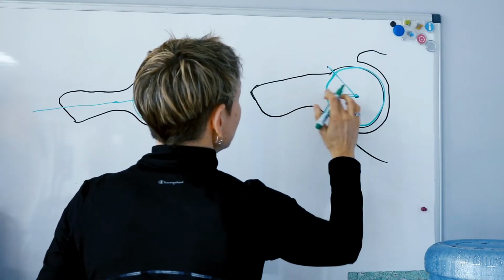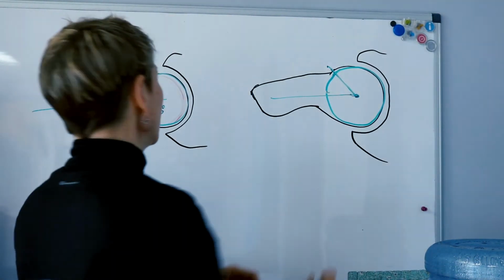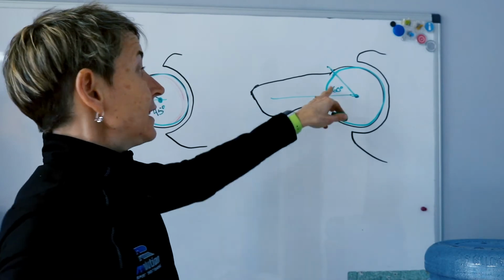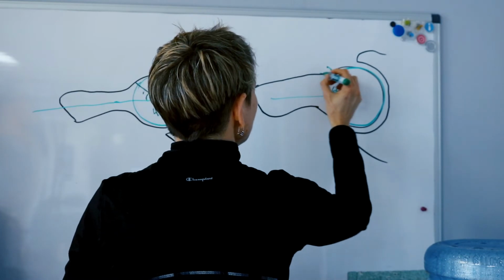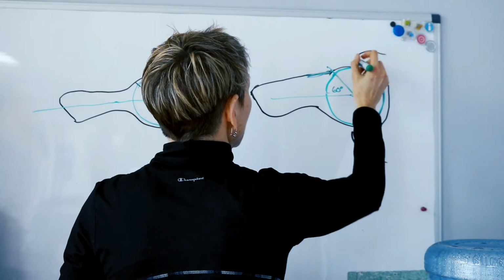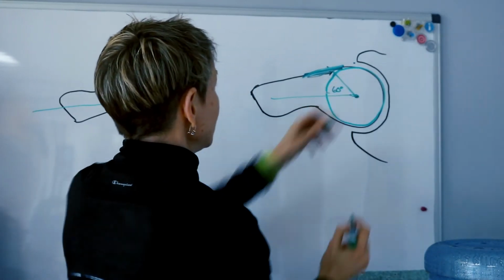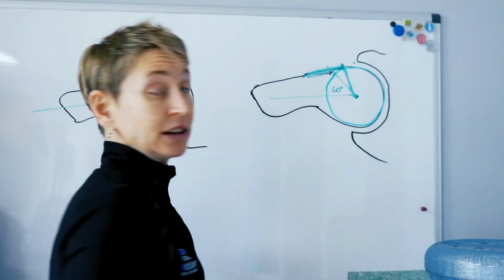And these almost look exactly the same, don't they? So let's, for instance, say there's our other line. So if we went in and measured this, well, this is more like a 60-degree angle, we'll say, for argument's sake. This would meet the impingement threshold. And you can even see, if this is sort of getting built up with a bony callus, it's going to impinge up here as you're rotating your hip, when you're flexing at your hip. This area is going to butt onto this area. So let's say even it's up here, that's going to be like a 75-degree angle.